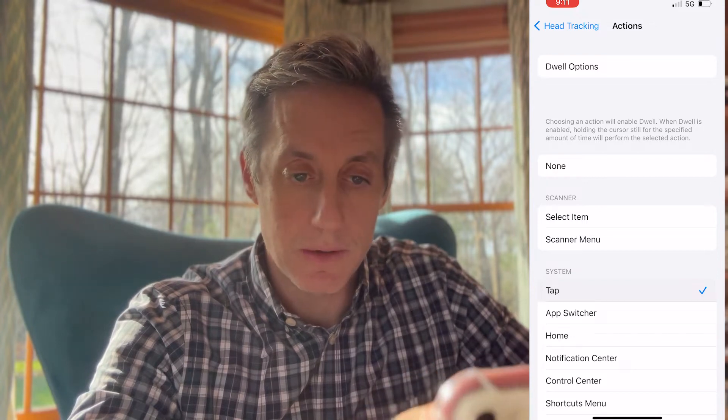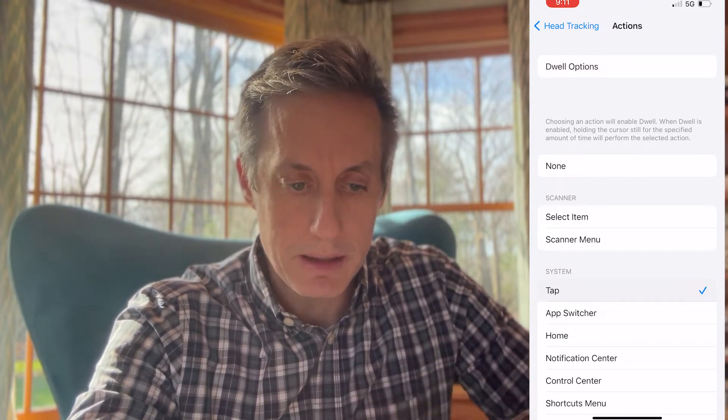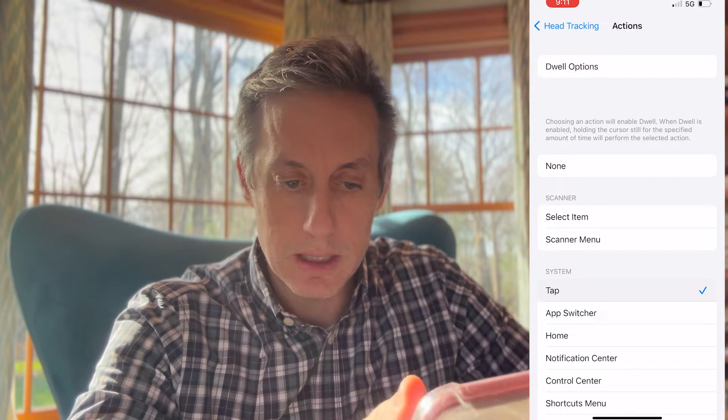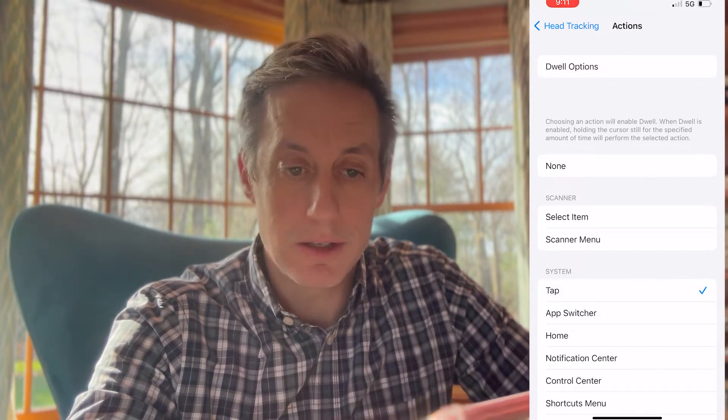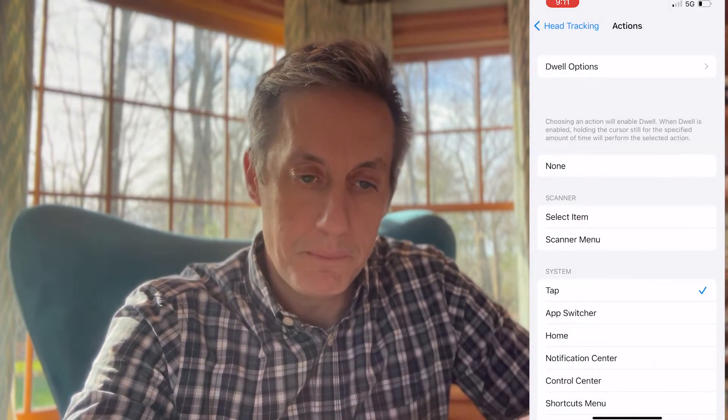For Maggie, Dwell is the best way to use it. It's the way her eye gaze computer device works. So I'm going to turn on Dwell, put Tap as what I want the device to do when she dwells, set how big the cursor is and how much time she needs in order to activate something. Then we'll go back.